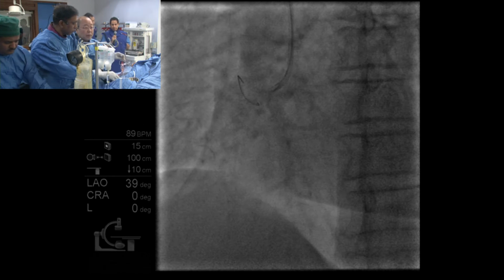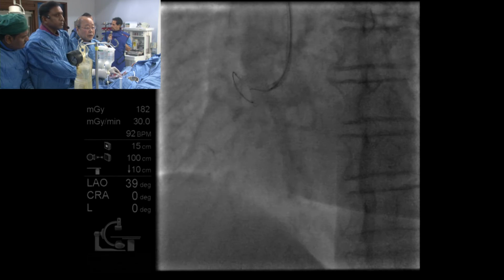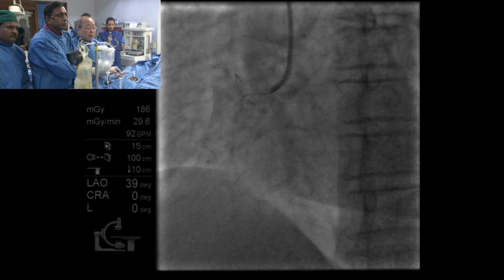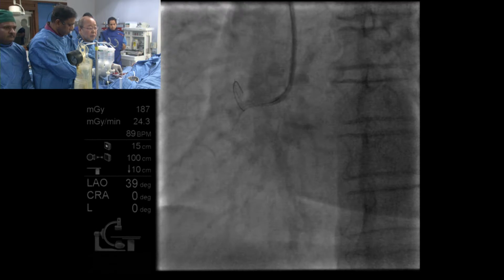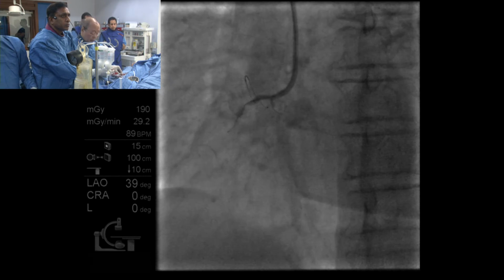I think we typically favor more of a US approach, which is to be ready for everything and choose the best strategy in an algorithmic manner. We learned that from Aaron Grantham and his papers and experience, recognizing there are different ways of doing this. Even though we see a good retrograde collateral in the beginning, most of us still try antegrade wire escalation first.